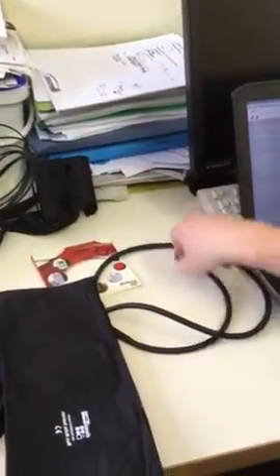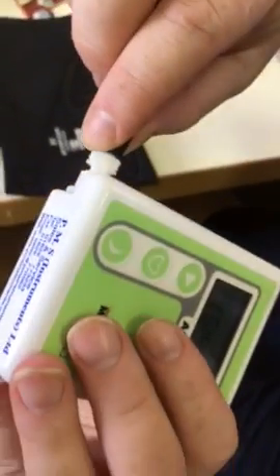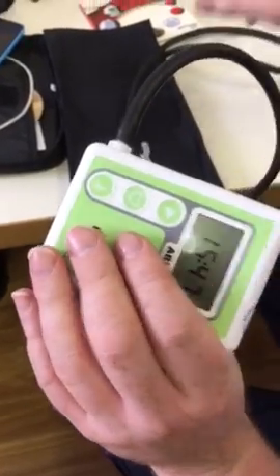In order to just test it before the patient goes out, what you need to do is connect the blood pressure cuff. So you can see there's a place for this to just easily slide into, but then you have to twist to tighten. So slide in and it clicks again. So I'm just going to briefly place this on a kind volunteer here.